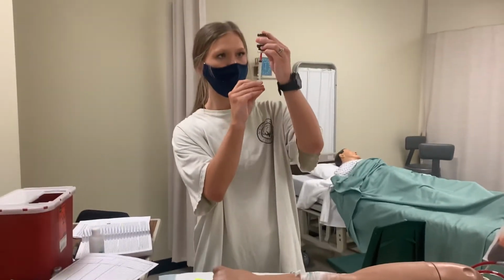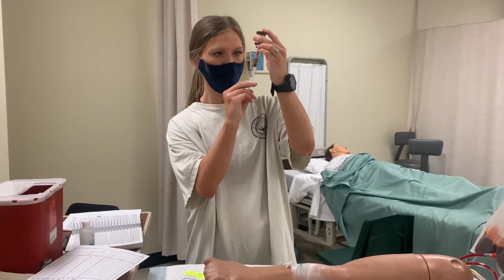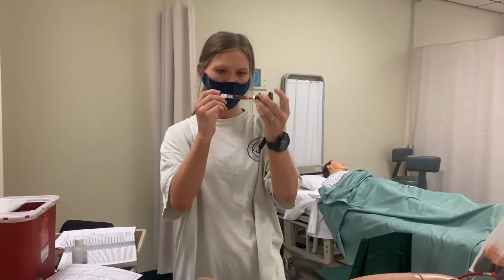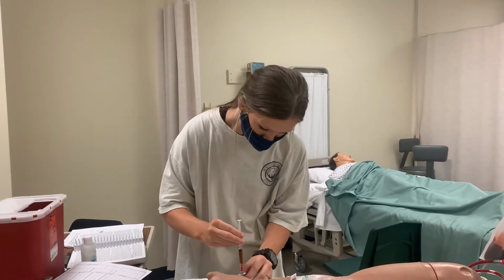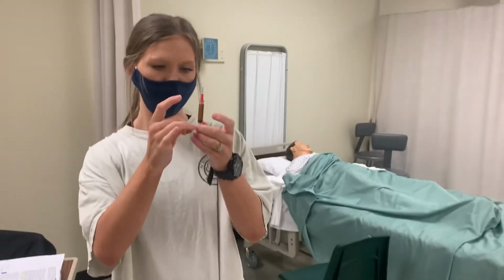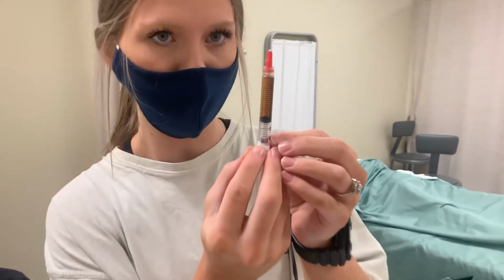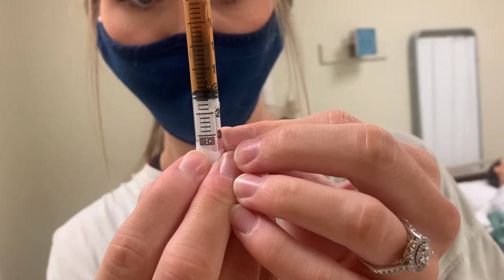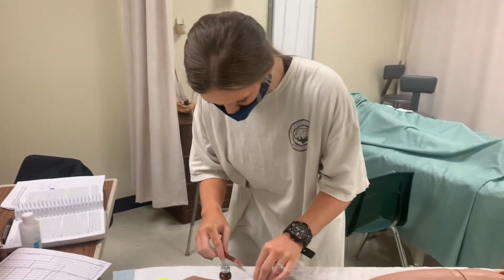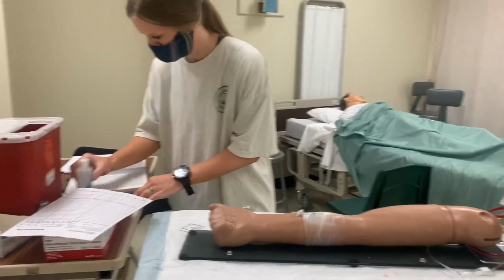So I worked out my problem, and I'll draw up 2 milliliters to give my patient 2 mLs of furosemide. So I'm pulling back 2. I'm going to inject air into my vial. Make sure there are no air bubbles. Okay, so I have pulled up 2 milliliters. Now I'm going to scoop this cap back on, and I'm going to prepare the label.